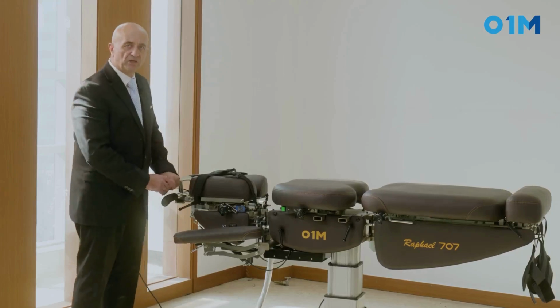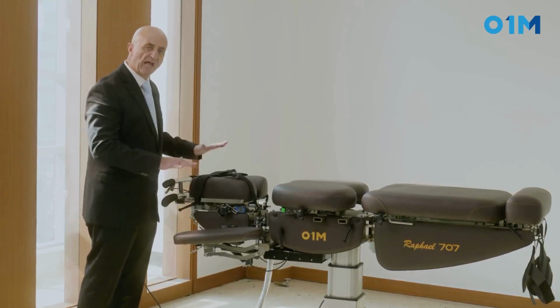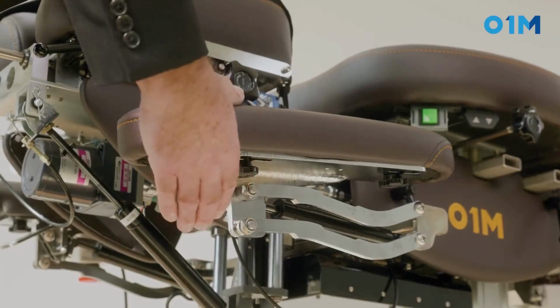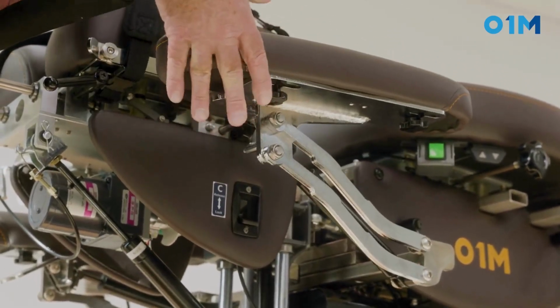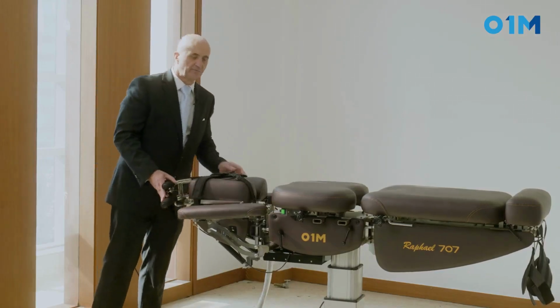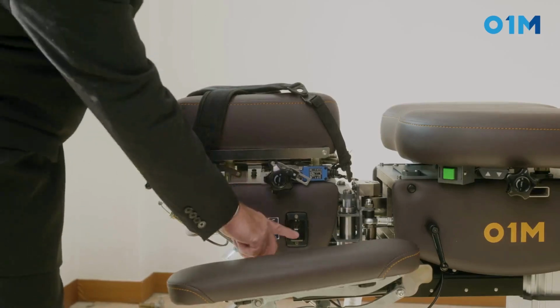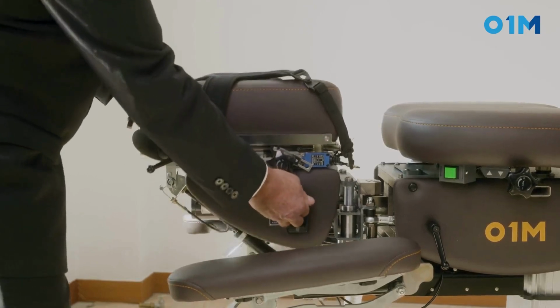When treating a patient supine, you want to have the hand rest up so the patient can relax. And for that, you're going to just press on the bottom of the hand rest and gently raise it up. And you do that on both sides. Okay, the headpiece can go up and down. The button down is locked. Up, we can bring it up.